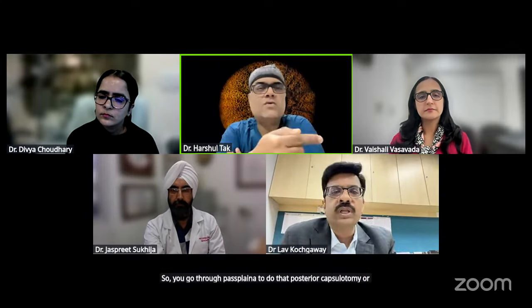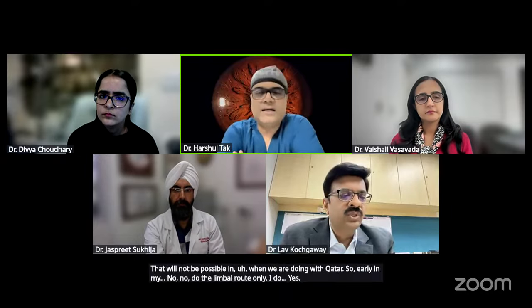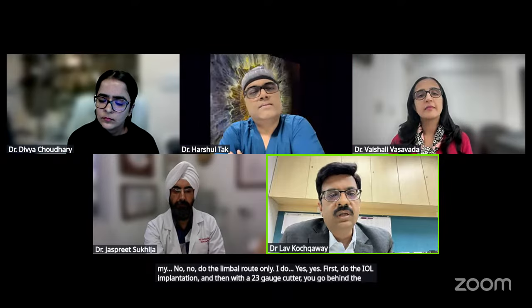So you go through only pars plana to do that posterior capsulotomy, or you go through the limbal route only? I do limbal only. First do the IOL implantation, and then with a 23 gauge cutter, you go behind the lens and do maybe a 4 millimeter posterior capsular excision with a high speed cutter. It's a very smooth margin.